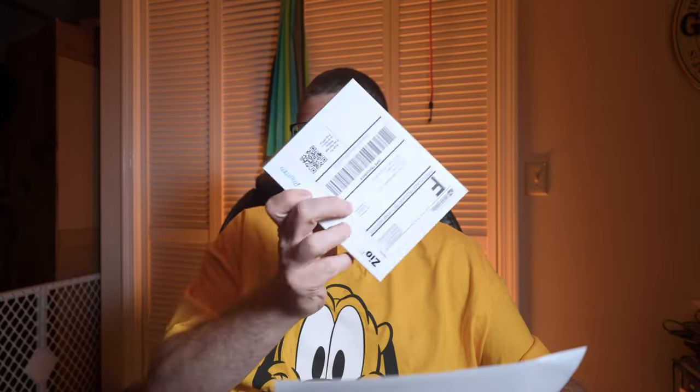Step three: return. Remove your Zio at the end of the prescribed wear time and place it into the blue box in your system log and drop it into the mailbox. The box is pre-addressed and prepaid. Step four: review. Once we receive your Zio, we'll send a report to your healthcare provider. Note: the Zio is the property of iRhythm Technologies — please return it to avoid being charged for an unreturned monitor.